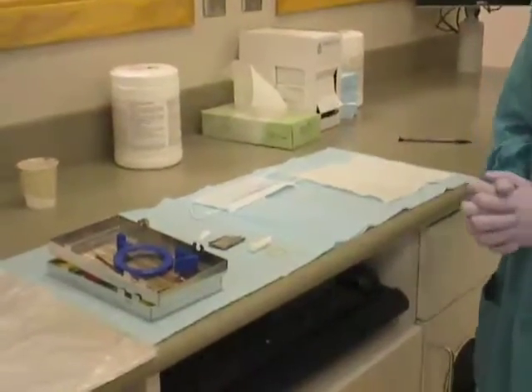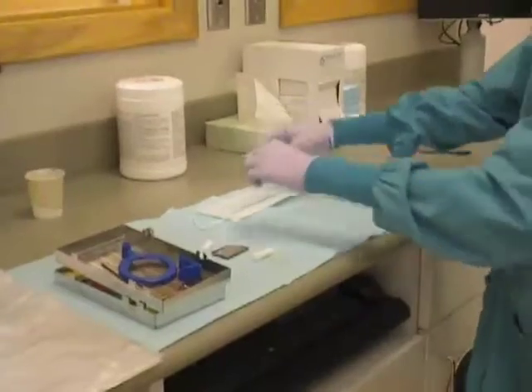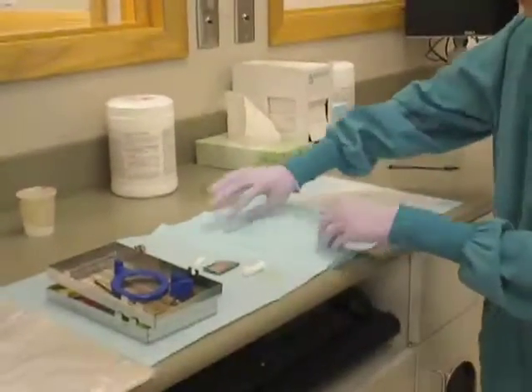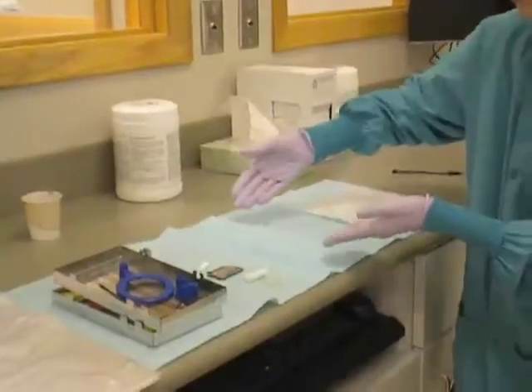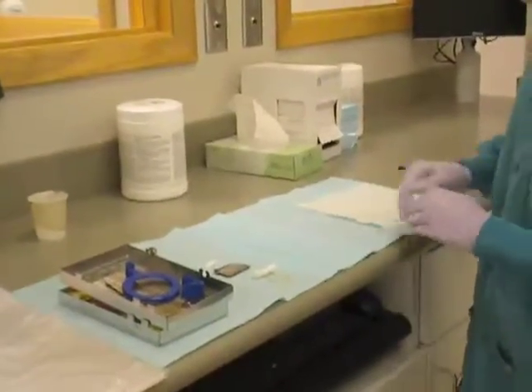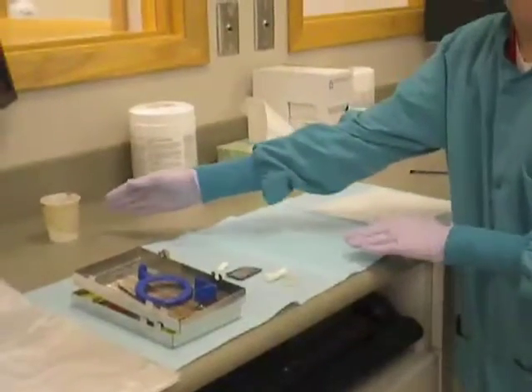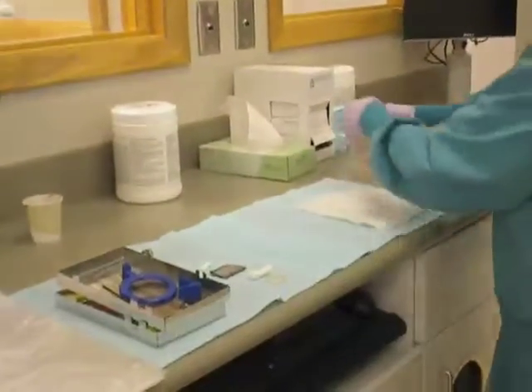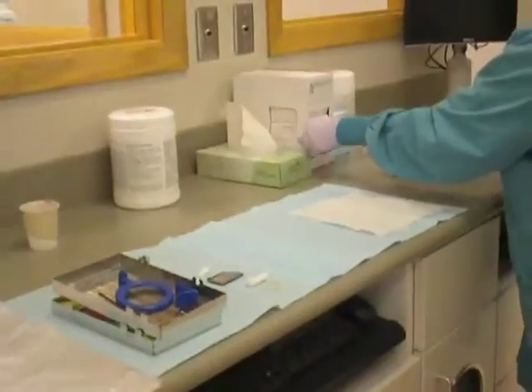Put gloves and mask on prior to setting up the unit. Place two napkins with the dull side up. Place the cassette, Kleenex, and phosphor plates on top of the napkin. Keep the cup off the contaminated napkins and handle only with bare hands after exposure. Cover the exposure switch with barrier tape and cover the chair with a plastic bag.